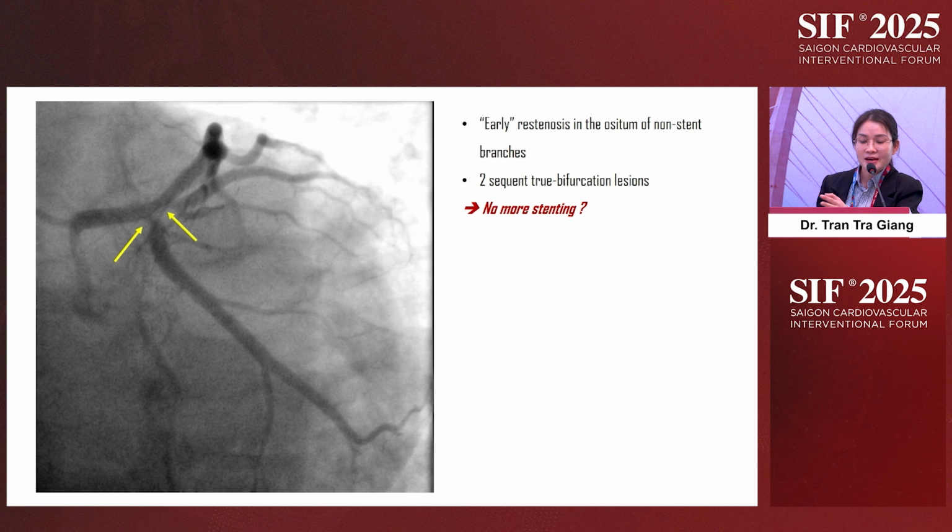For the left main, I think a 4.5 mm DCB is good, and we have flow into the LAD. But for the LAD and the left main, with a bigger 4.0 mm balloon, we will totally occlude the circumflex, LAD, and diagonal. What would happen?